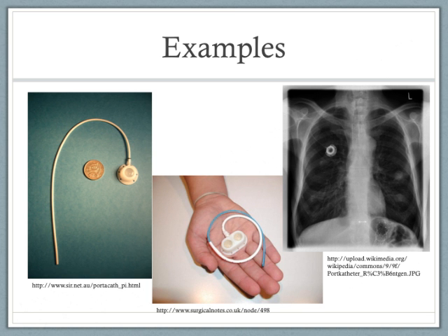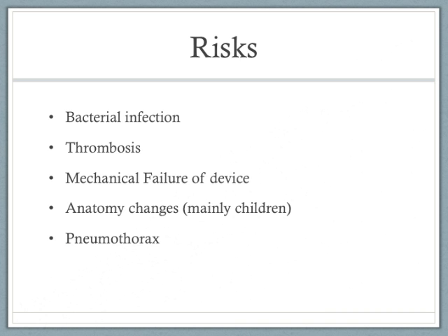There are risks associated with the ports, not only with the implantation of it, but every time it is accessed, and pretty much just from having it placed in the patient. One of the main concerns is bacterial infection. A bacterial infection can clog and or compromise the device. When this happens, the device has to be removed, and another one has to be inserted.